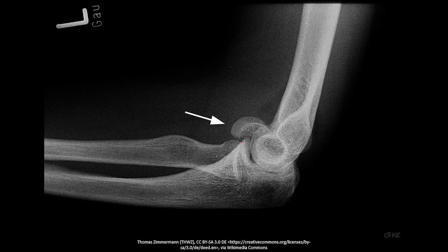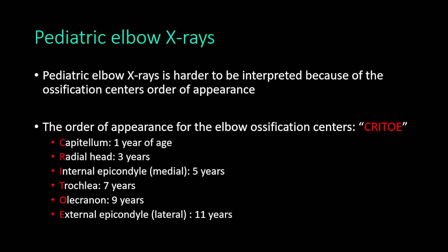In this example of a lateral elbow x-ray showing a capitellum fracture, the fracture causes bleeding and fluid collection that pushes the fat pads away from the joint. The anterior fat pad is elevated and the posterior fat pad is visible and elevated too, confirming joint effusion resulting from the fracture.